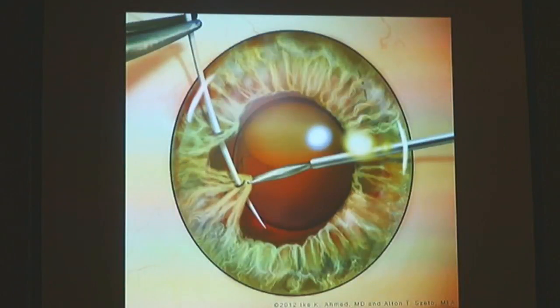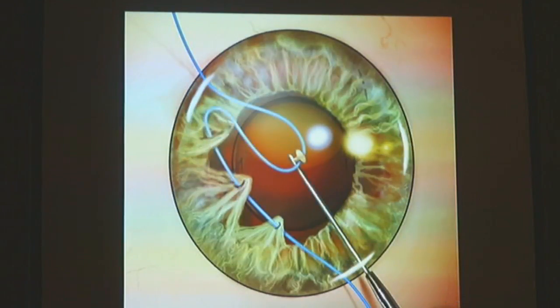This is the McCannel technique. Place the needle through the iris, whatever bite you need. Pull both suture ends.